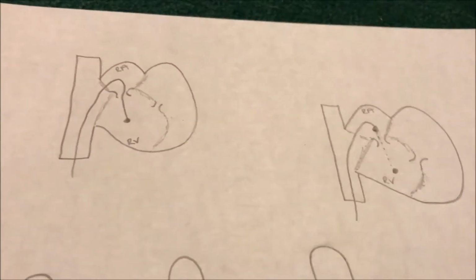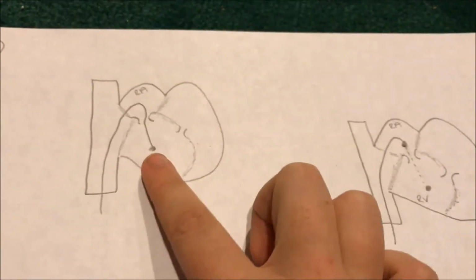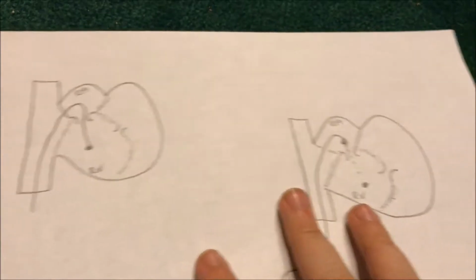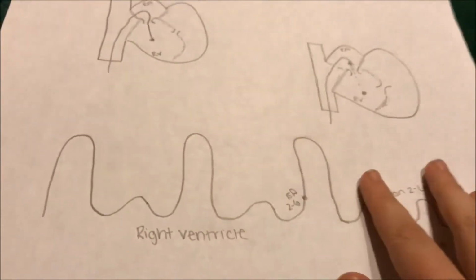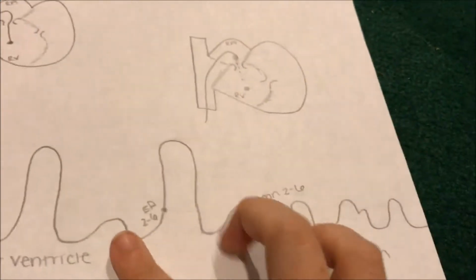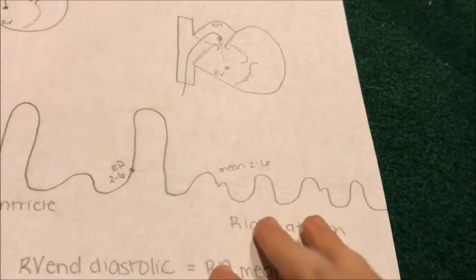Next, we were in the right ventricle, just as we ended the last one. We are going to pull it back into the right atrium, crossing the valve. This is the waveform for the right ventricle. We pulled it back and we've got the right atrium.